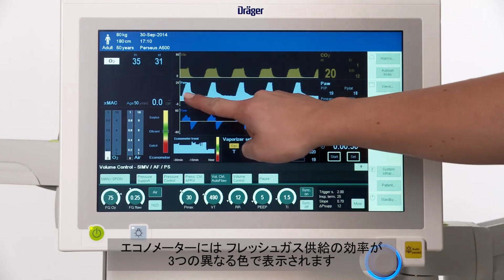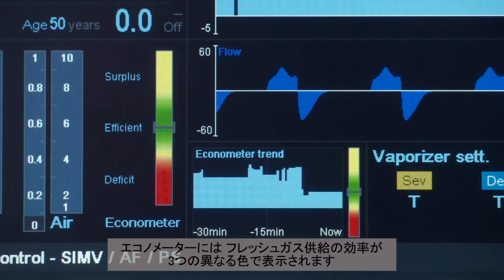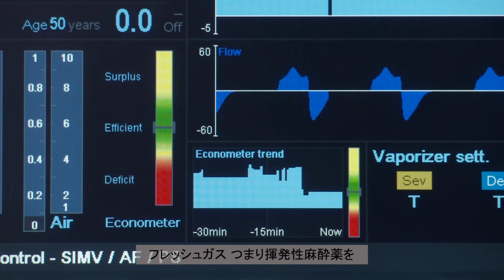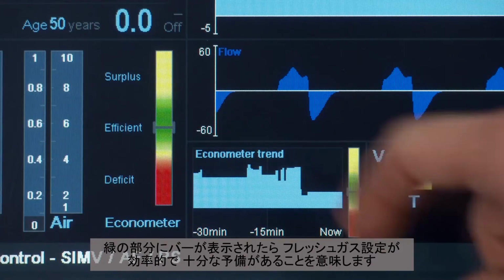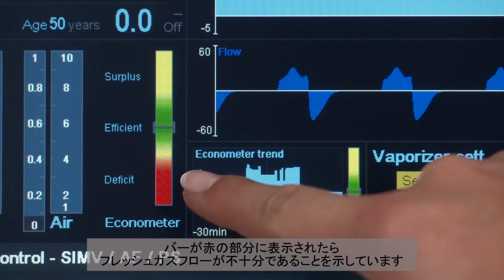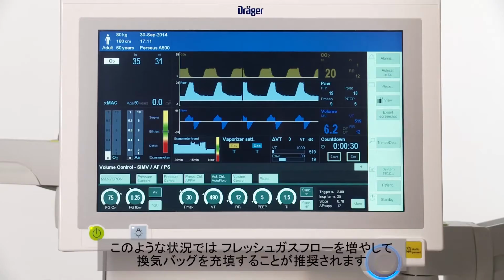The econometer displays the efficiency of the fresh gas supply in 3 different colours. When you see the bar reaching the yellow section, this means there is a potential to save on fresh gas, hence on volatile anesthetic agents. In the green section, the bar indicates that the fresh gas settings are efficient and provide sufficient reserves. If the bar drops into the red section, this is an indication of an insufficient fresh gas flow. In this situation, it is advisable to increase the fresh gas flow to fill the breathing bag.